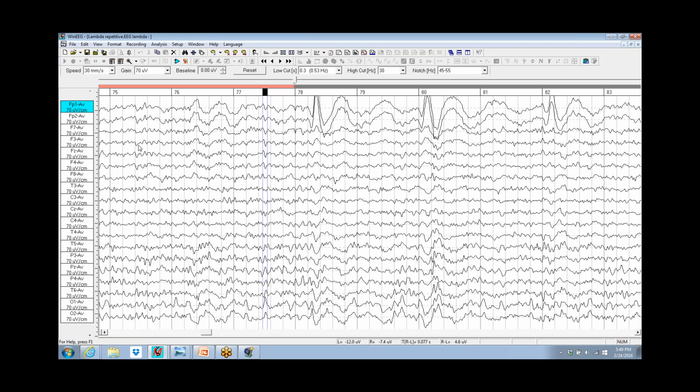So the EEG is an ongoing mix of rhythms that are ongoing and events that are individual events. And as such, you don't see the individual events because they're not averaged up. You have to average. We typically see 100 of them averaged together to get a nice stable waveform. You can get by with 40, but you still have a noisy waveform. And at 100 repetitions, the EEG averages out, and the ERP averages up.